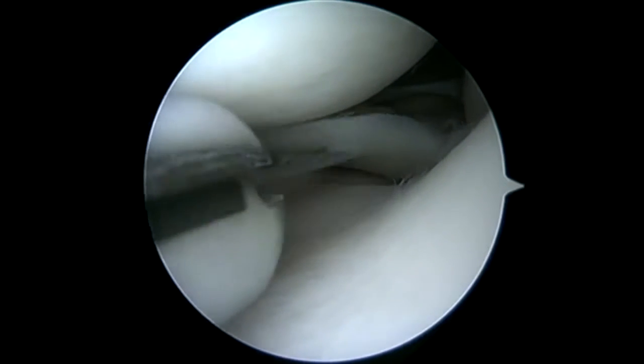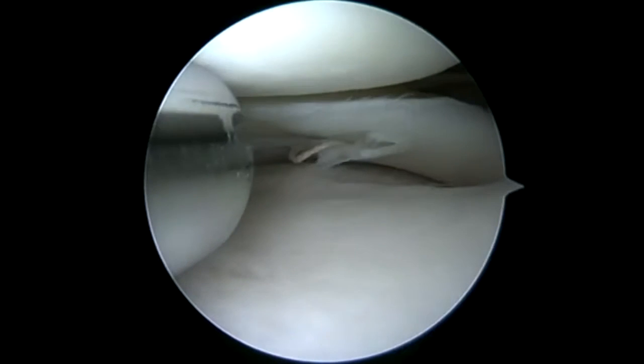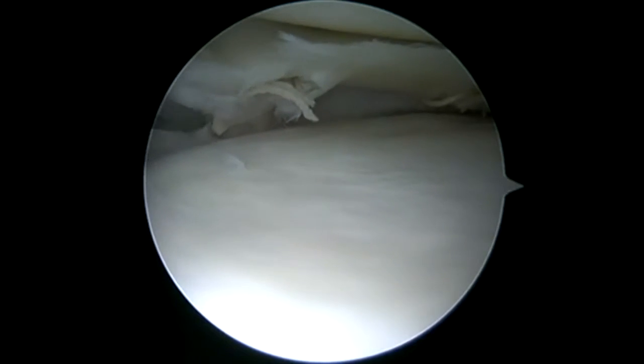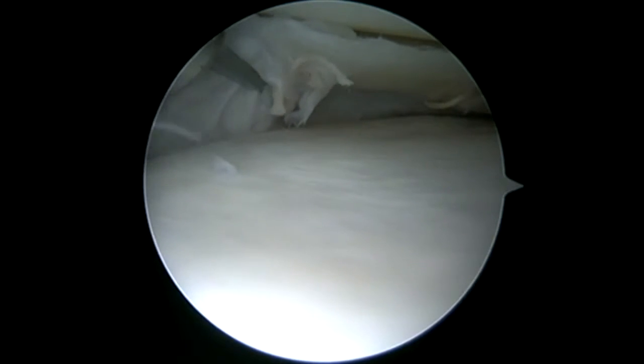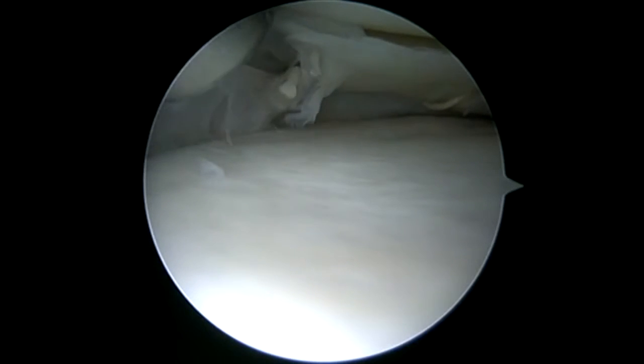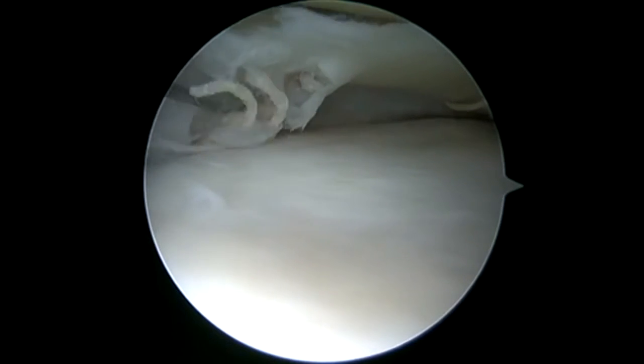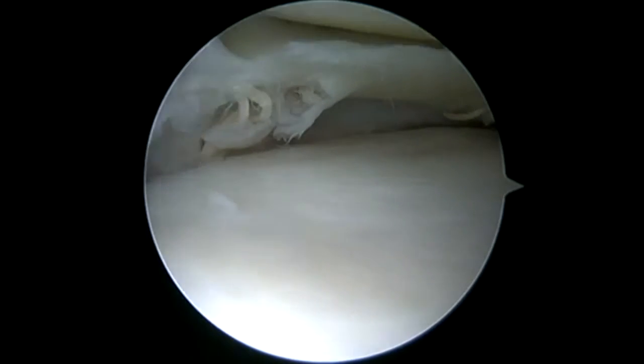Here I'm opening up the meniscus to give me better access. In this patient I have the luxury of also knowing that she has a Baker's cyst back here, so I can push the implant back into the Baker's cyst and store it there instead of having to retrieve it. So here I'm just going to carefully cut this out, preserving as much meniscus as possible, and I'll retrieve this implant. For the posterior implant, I simply shoved it back into the Baker's cyst.